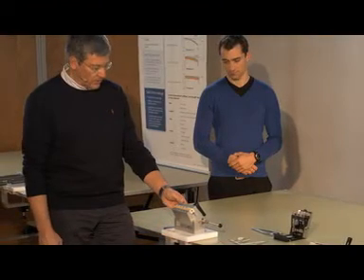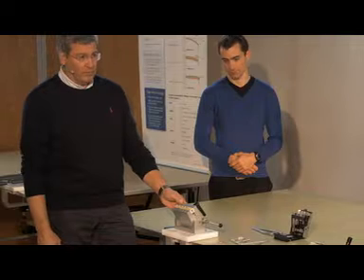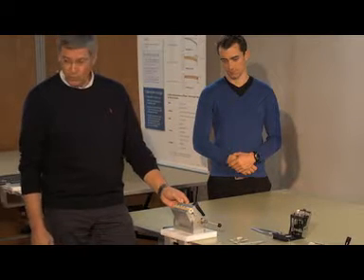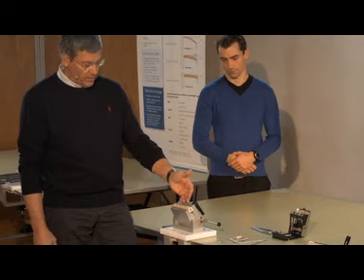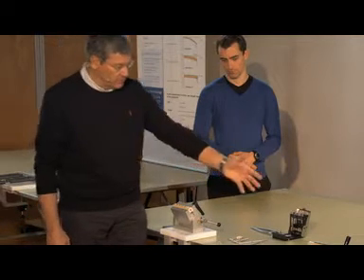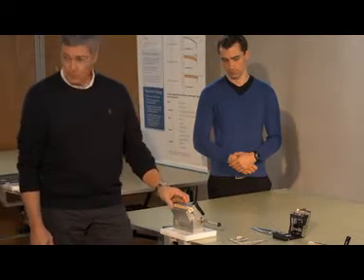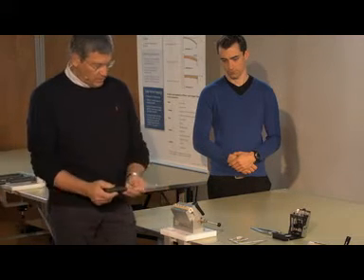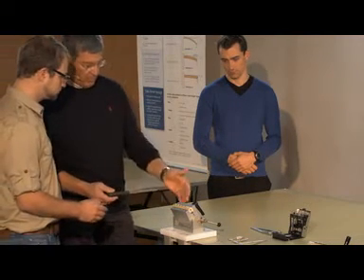Here we would like to demonstrate implant removal if the implant is damaged. Now what we will do, we will snap off the head of a screw and we will demonstrate how we can use different instruments in order to remove the screw. So I want you to take the screwdriver and snap off one of these heads.